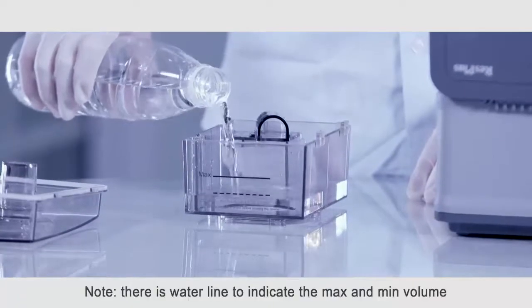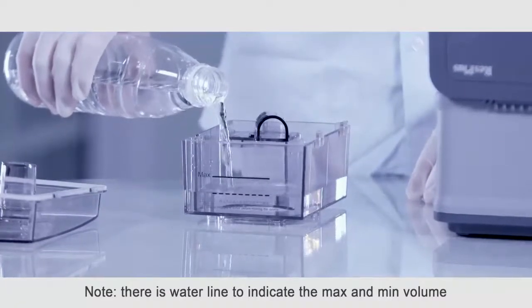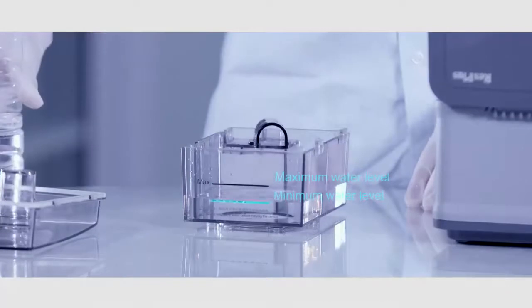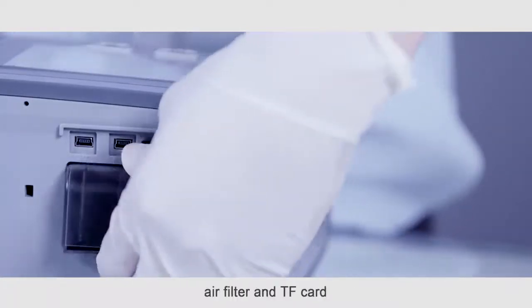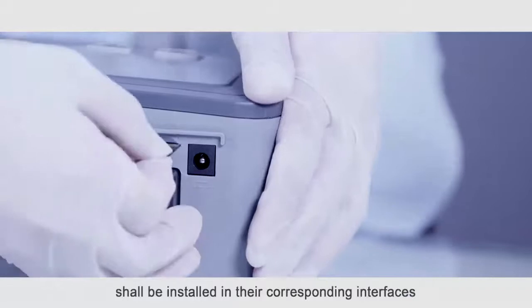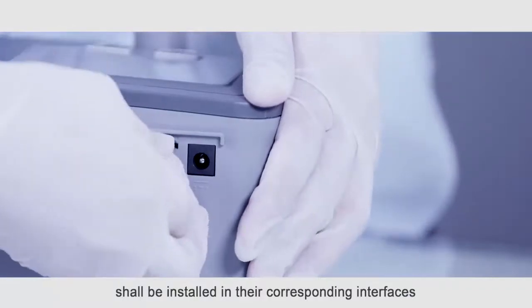Note: There is a water line to indicate the maximum and minimum volume. Before using, air filter and TF card shall be installed in their corresponding interfaces.